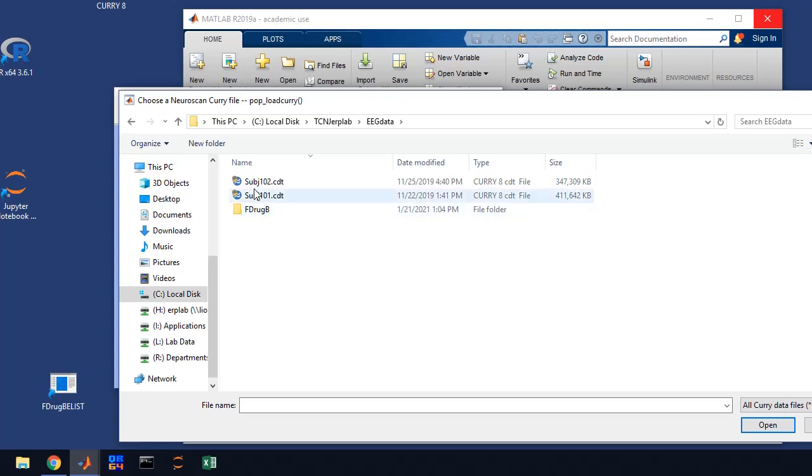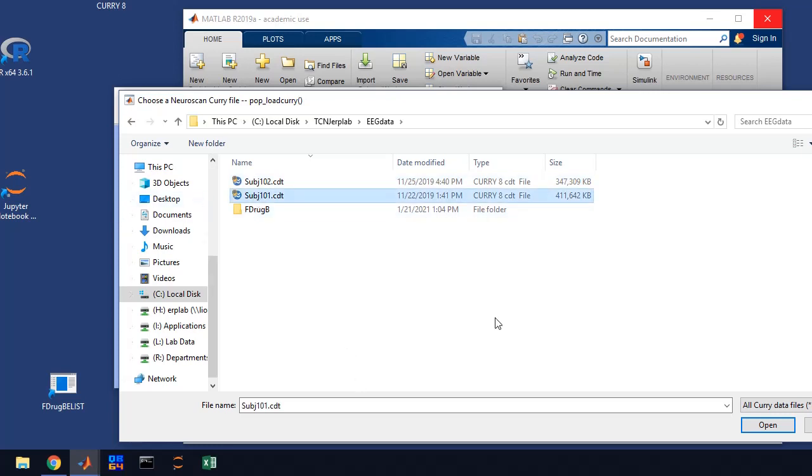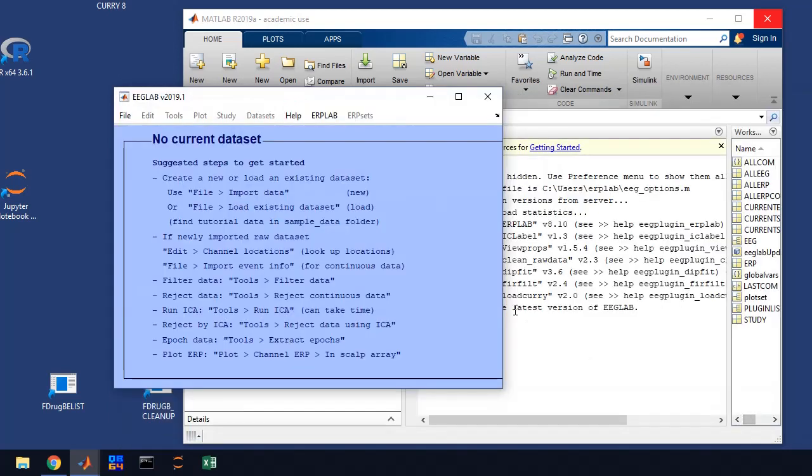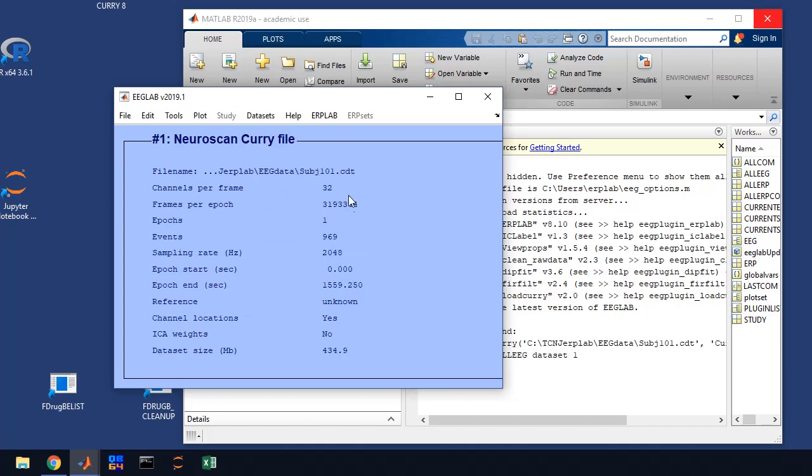Here you'll see the EEG data that's stored. When you're using curry 8, curry 8 automatically names the subject file. You're going to select the subject that you want to process. We're going to do 101 in our example here and click open. That's going to load it up into EEG lab.